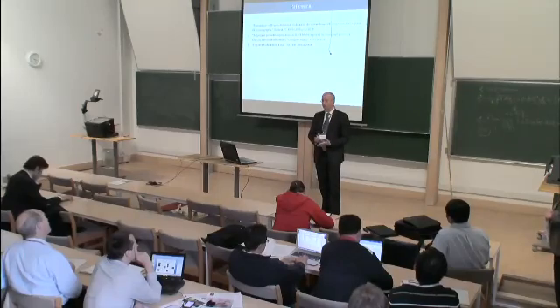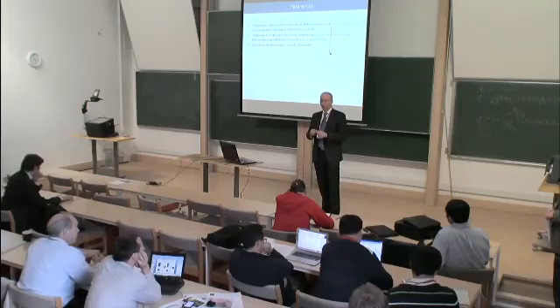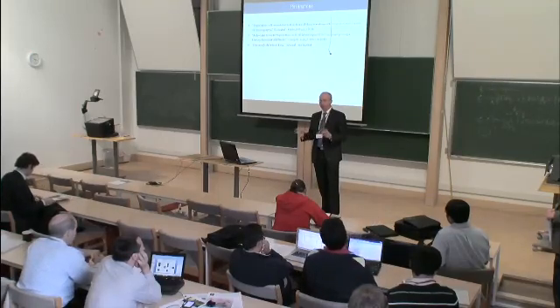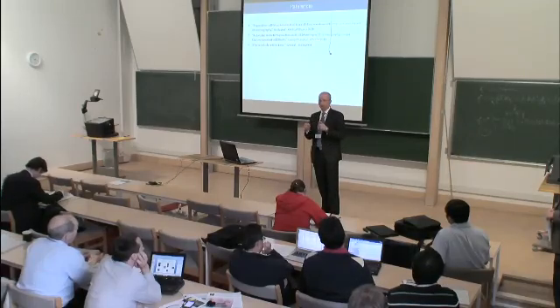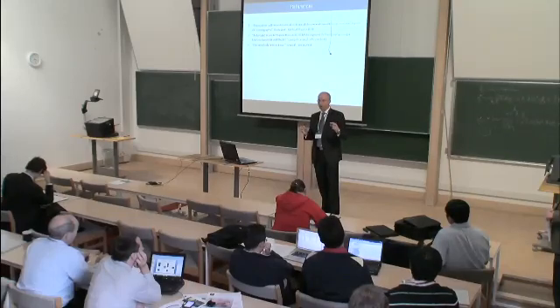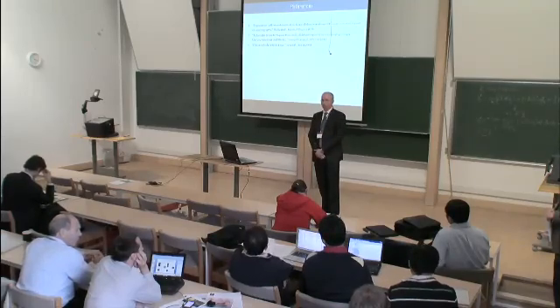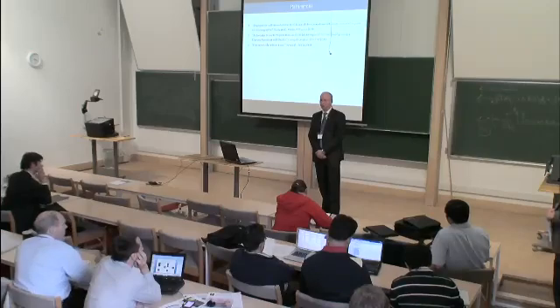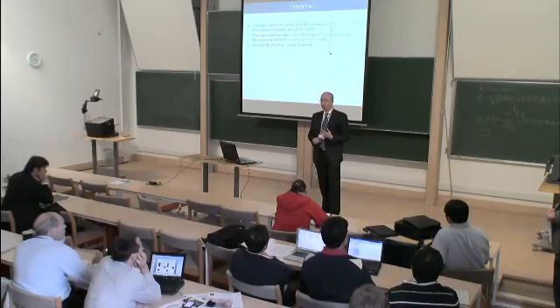That's for visualization. For CAD, it's a slightly different story because you want it to be as accurate as possible. If you're going to filter regions out based on the registration, the way we did it was dependent upon a radius. So if you have a misregistration that takes you very far away from a true polyp, then it's possible you would have false negatives as a result of this filtering. We didn't experience that in our results, but it's possible if there's a bad registration. So I think the key in that application is to know when the registration is good and when to use it, and that's something we're looking into.